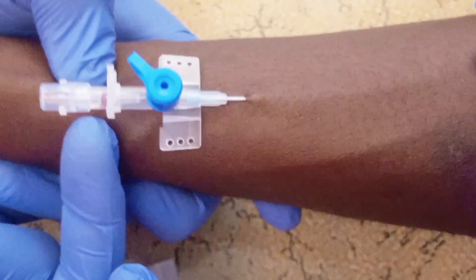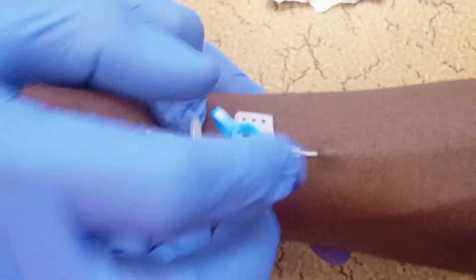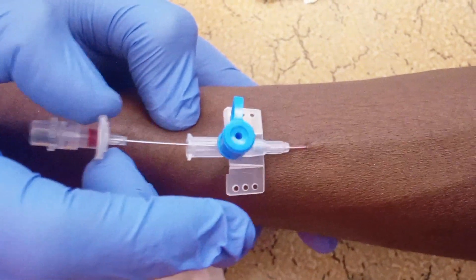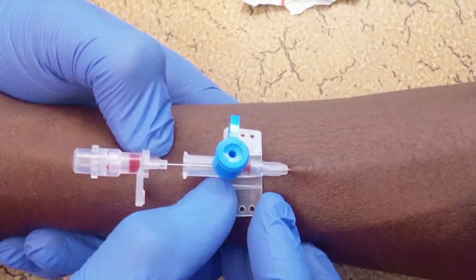I hope you can see there is a flashback here — a flashback into the cannula's chamber. What you do is pull back the cannula slowly, pull back the needle slowly, and ensure there is blood. I hope you can see this blood. Then you advance the cannula deep into the vein.